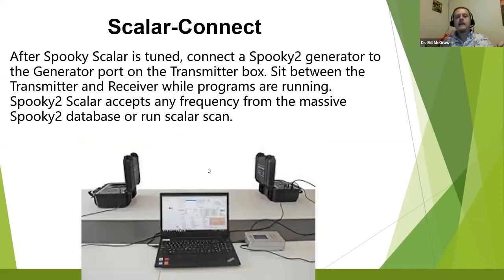All right, then we connect our two scalar boxes. There's a wire that goes from this box to that box. This is the transmitter box. This is the receiver box. We connect them and then we sit in a chair or lounge chair, like what I have for my clients. And then we run our scan. The scan takes 8 minutes. At the end of the 8 minutes, we look at our resonant frequencies that we use to engage our treatment process. So we kill parasites.